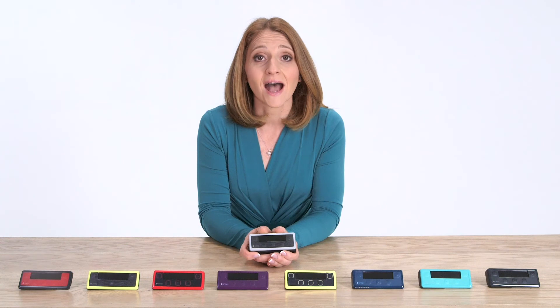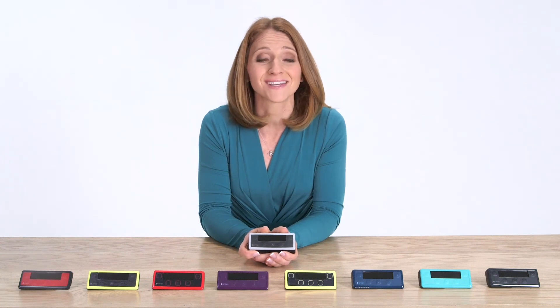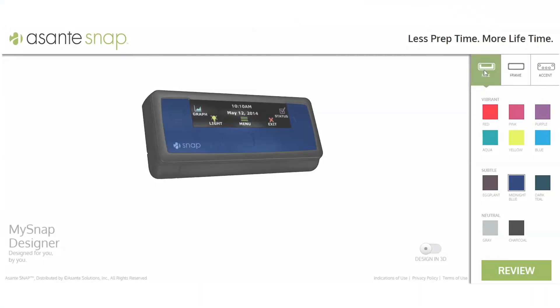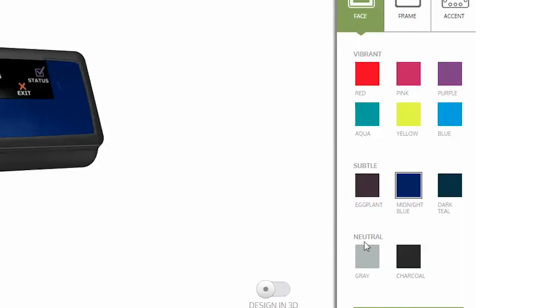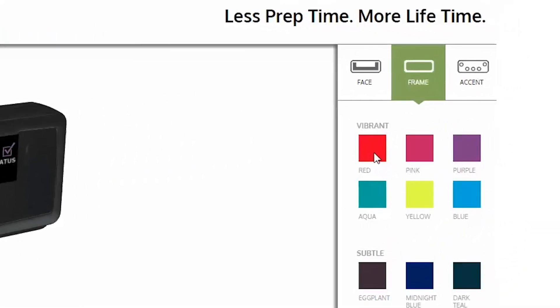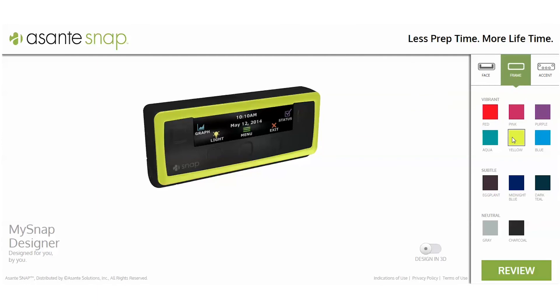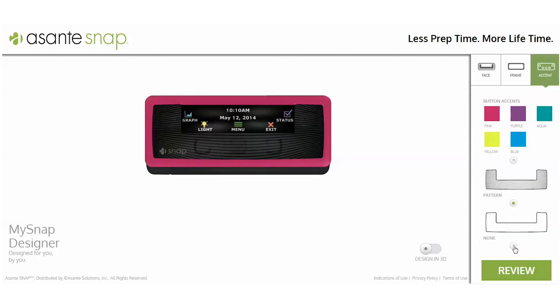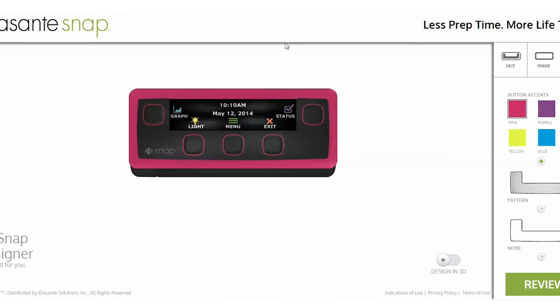My controller is unique because I designed it myself. Only SNAP lets you choose the look of your pump to fit your unique style. You can choose your color in three simple steps at snappump.com. On the faceplate, you can choose from three color families: vibrant, subtle, and neutral. I really like charcoal, so I'm going to go with that. Next, pick your frame color — you have a variety of options, so try out a few and see which one works best for you. I'm going to pick pink as my frame color. Last, you have the chance to choose whether or not you would like an accent. Three simple steps and you have a SNAP pump designed for you by you.